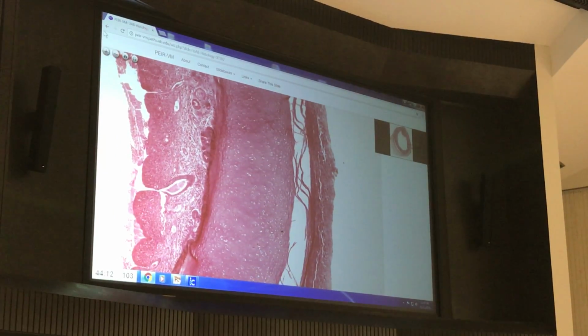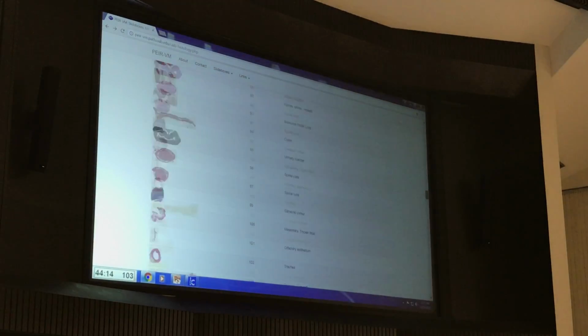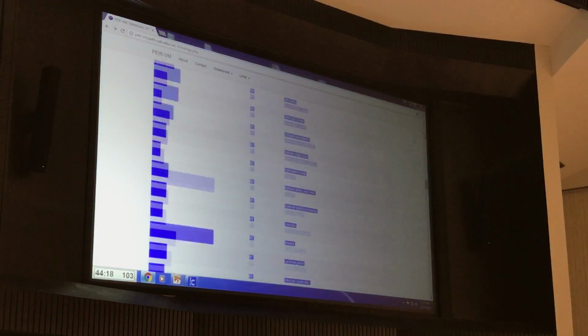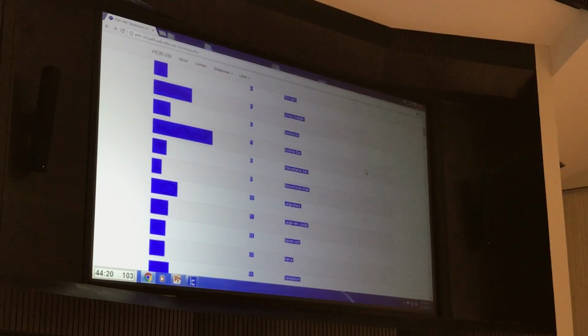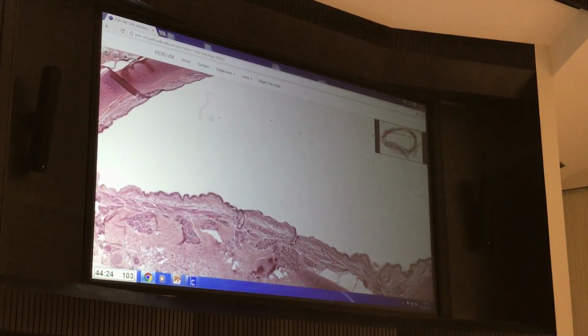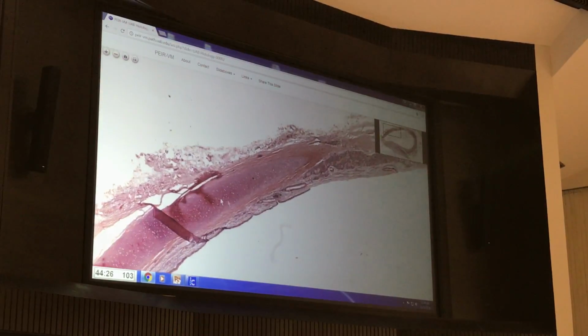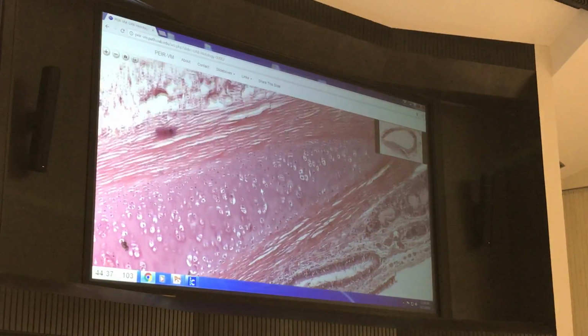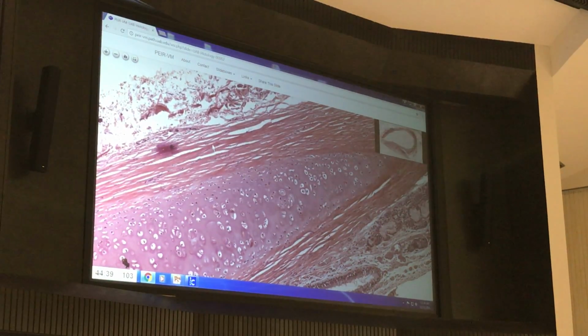Number 2 is a little lighter. I wouldn't expect you to know this, but this is cartilage here. And you see how it has this nice little band of cellular fibrous material? Can you see that this is dense regular?